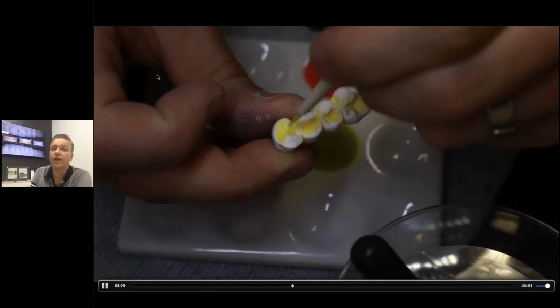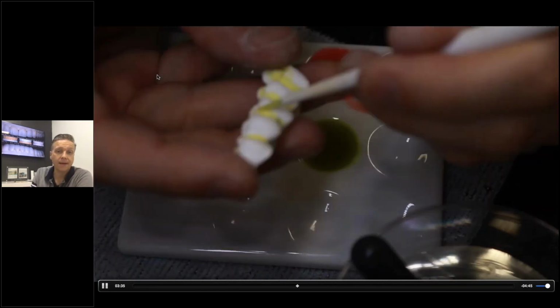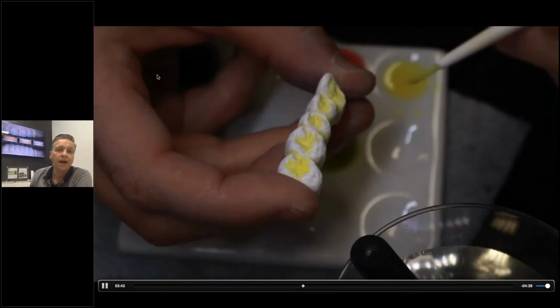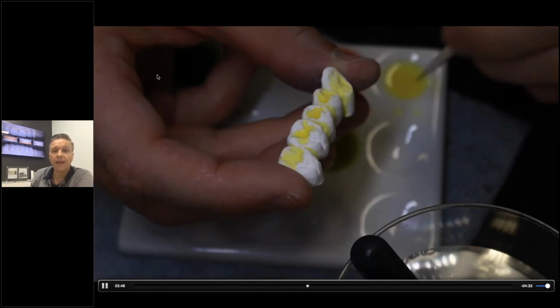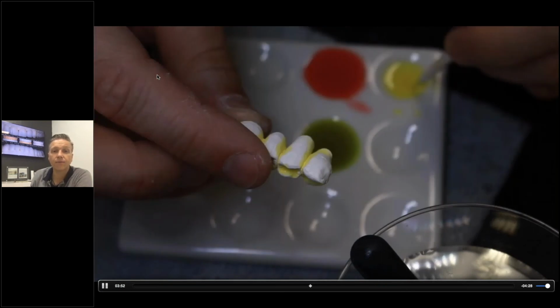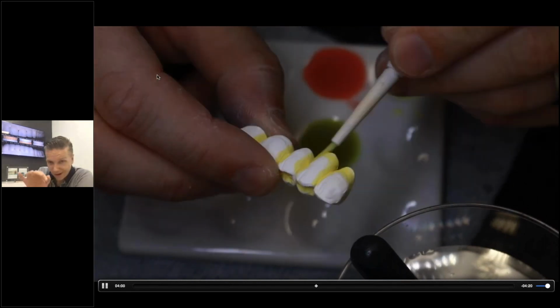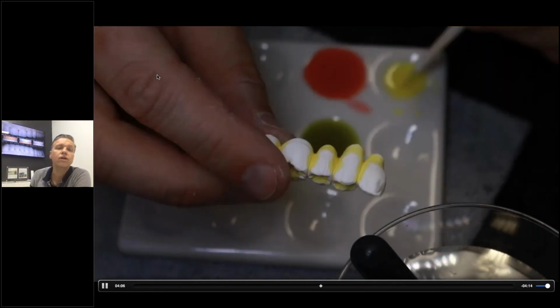Then usually I go with the A2 again over the cervical area or the whole body, then a second time with A2 just over the lower body and the cervical area, and the third time just over the cervical area. So I have these 1, 2, 3 layers from incisal down to the cervical. And then I start utilizing my incisal colors. That's very, very important. Then certain effects, a little bit of orange sometimes, but very, very careful. Just the tip of the brush dives into the orange and puts a little dot in the middle, because the orange is extremely prominent.